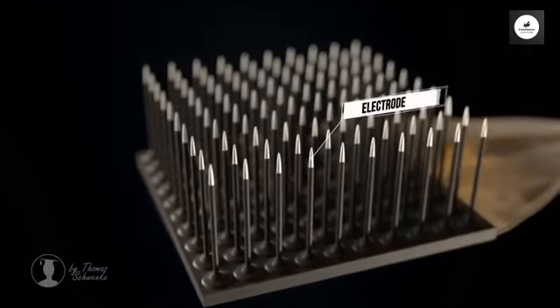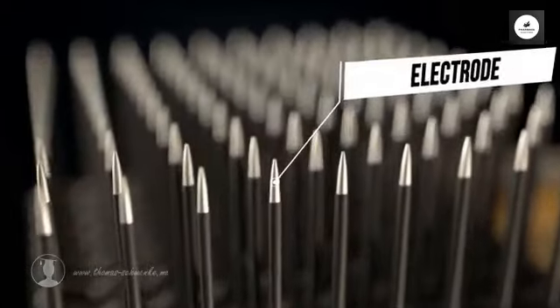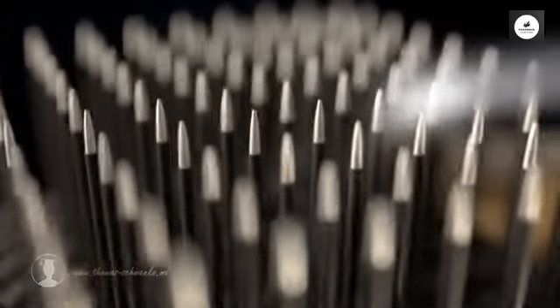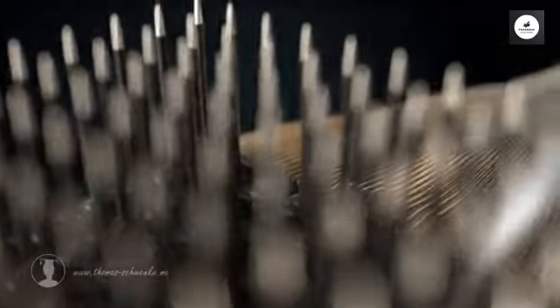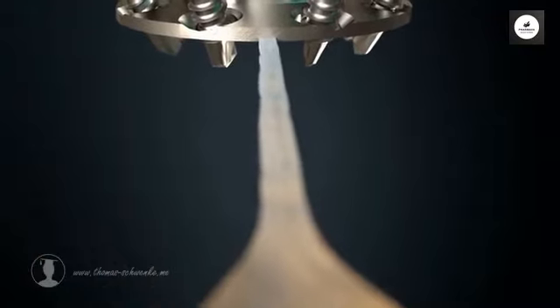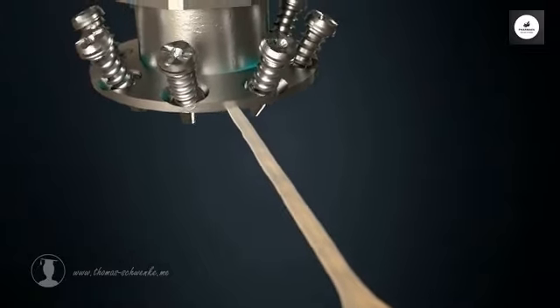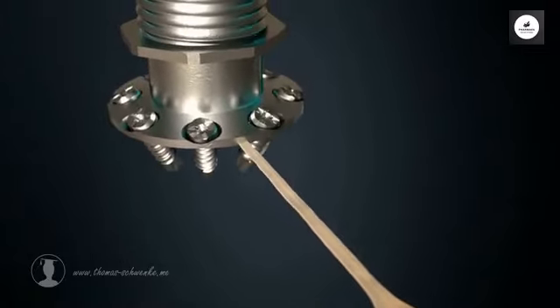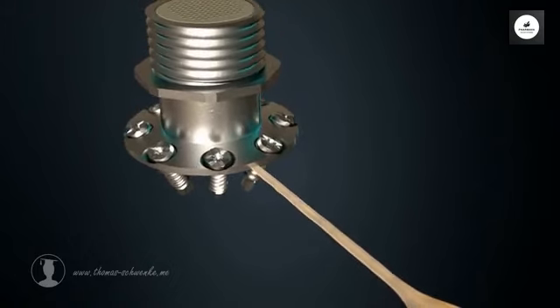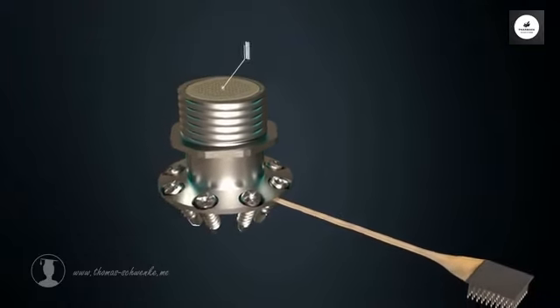Instead of stimulating brain activity, many companies are focusing on measuring it. For example, using a Utah array, which consists of different numbers of needles with electrodes. Each individual electrode is connected to a connecting piece by a thin wire. The connecting piece is usually screwed tightly to the skull using screws. It possesses contacts in the upper area so that a head stage can process the voltages recorded by the electrodes.